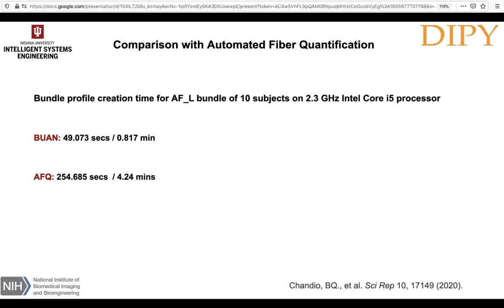So for BUAN, it took 49 seconds, and for AFQ, it took 254 seconds.